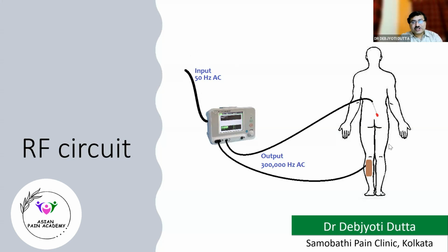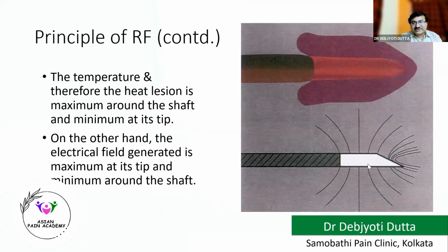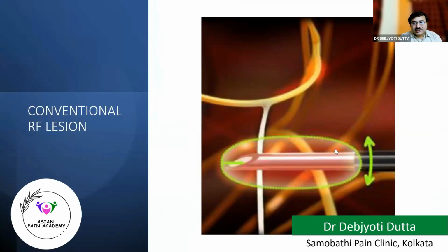So there will be no physiologic effect, but there will be generation of heat around the tissues close to the tip. Remember, it is by the thermal effect of the current within the tissue. So the tissue is heated first, and from the heated tissue, the heat is transferred to this tip, to this thermocouple, the tip of the needle, and then it heats the thermocouple. But as they are a very small volume, very small mass, they heat up instantaneously, within a few milliseconds. It can sense the tip temperature.